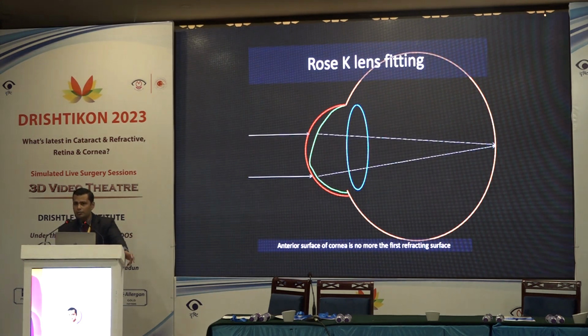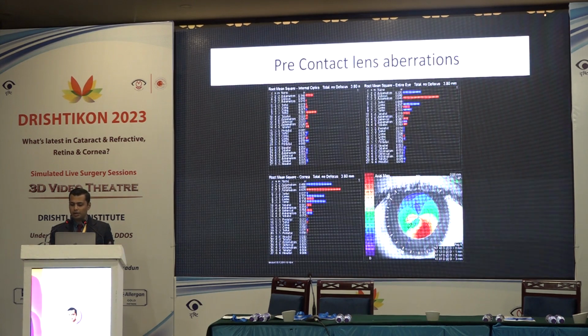optical system. And a lot of people who are using contact lenses will swear by the optical outcomes of a contact lens over any surgery, because this is what it does. And it's very simple. You can do it even with your own hand using older machines, but this tells you that the point spread function changes and the patients are extremely comfortable.